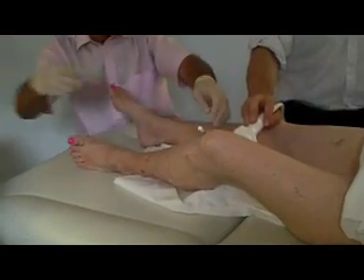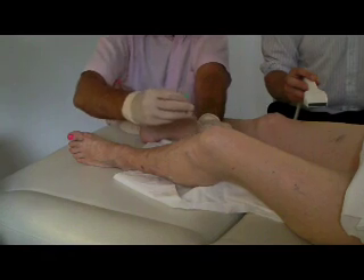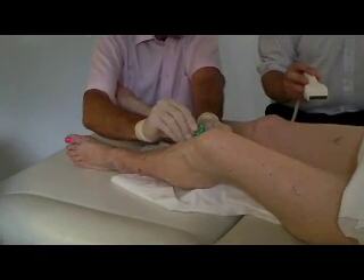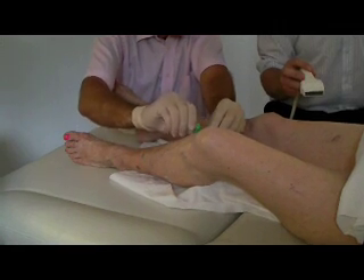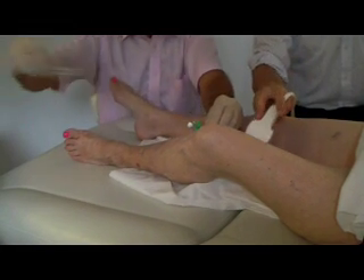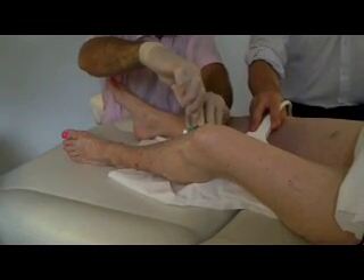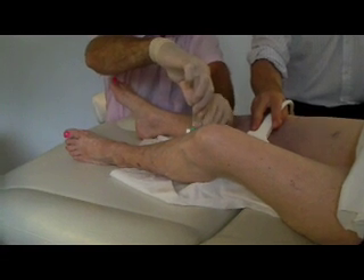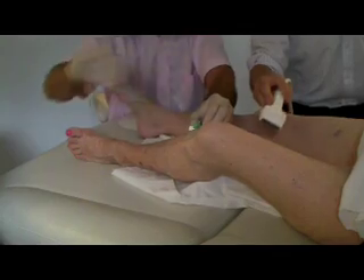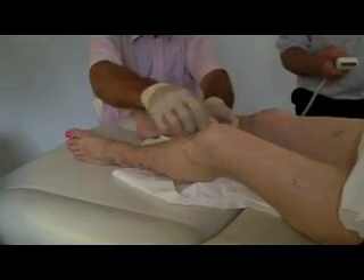Once the tube is in the right place the needle part is removed and a special cap called a three-way tap is then placed on the end of the tubing. This stops any of the blood inside of the vein leaking out. In order to test that the tube is in the correct place the doctor will then inject some slightly salty water into the vein, and this can be seen travelling up the vein with the duplex ultrasound.